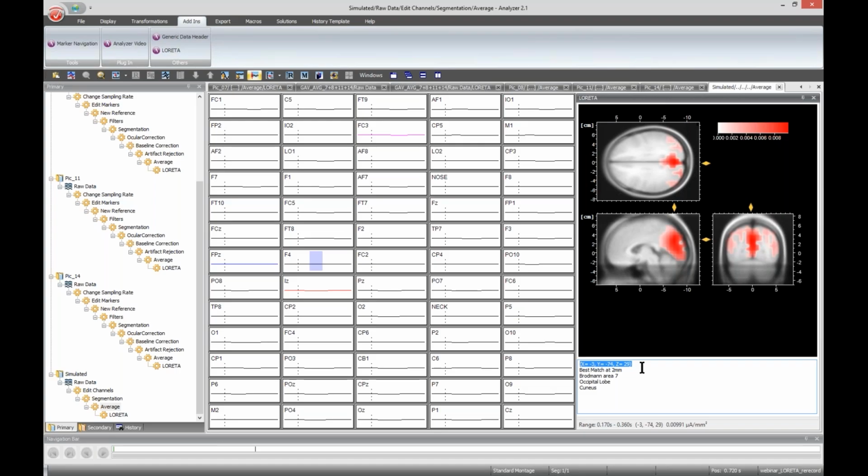Okay, so removing noisy channels not only decreases the number of electrodes, but it might also create non-uniform distribution of electrodes throughout the head. So this will then result in low localization accuracy because source localization is quite sensitive to the number of electrodes as well as the spatial distribution of electrodes. This is what also we have discussed in our recommendations. So therefore, it is advisable to make use of artifact correction techniques while preserving a uniform montage.